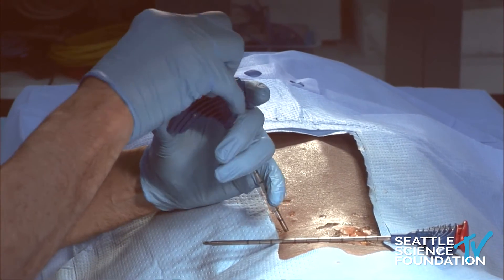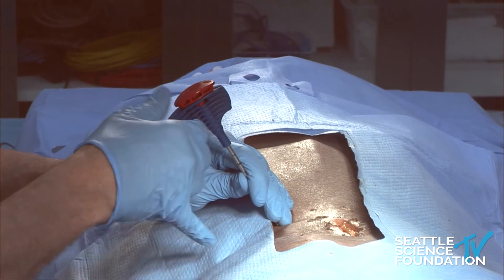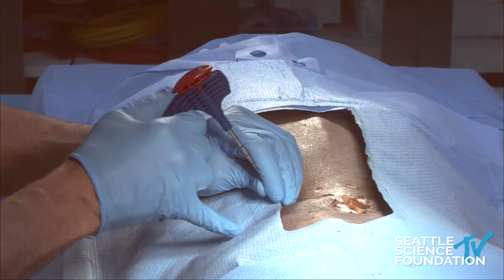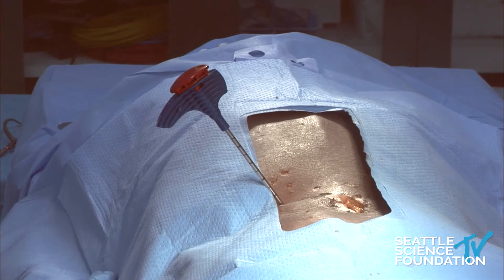This is also a flat approach — more of a nine o'clock and three o'clock than a ten and two. We've kind of started off here, and I'm going to drive it in there. It's a very flat approach, and we'll see where we are.